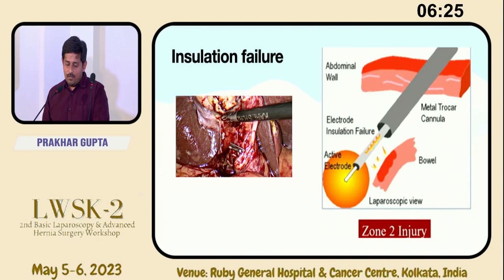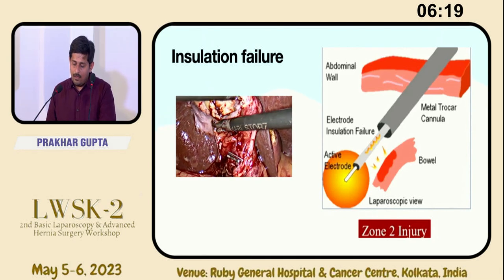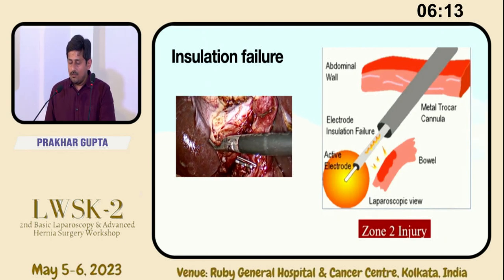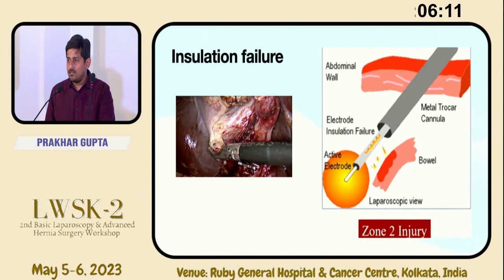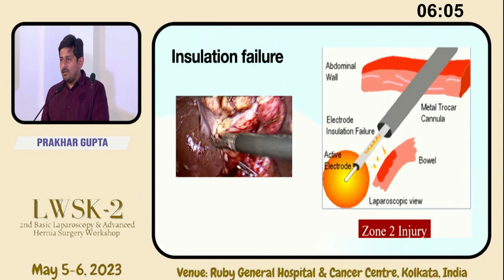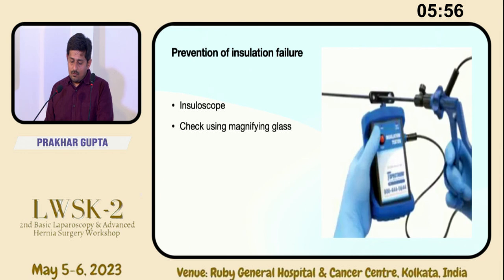Second is insulation failure. Here we can see in this clip that a large part of this instrument is not visible. Suppose there is a breach in the insulation sheath and we are applying current. That current will pass to the structure that comes in contact with that sheath. And the bad part is that these injuries usually go unrecognized during the surgery, and they are visible only after the patient comes in the follow-up. So how to prevent this? We have insuloscopes available, but they are very costly. Another cost-effective method is that we can check using a magnifying glass every sheath of every instrument before giving them for sterilization.